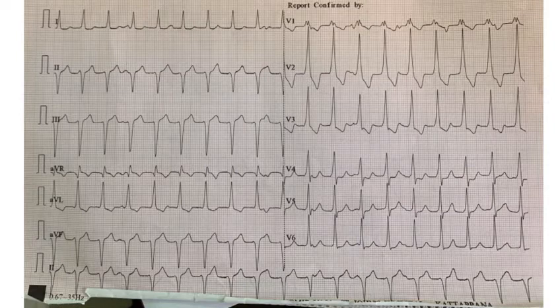So slow VT and the QRS is not very broad, so it could be a fascicular VT. Another possibility that you can think about is junction tachycardia. Junction tachycardia with retrograde block also is a possibility. But of these, I think I would go for a fascicular VT, and if it is fascicular VT, where is it starting from?